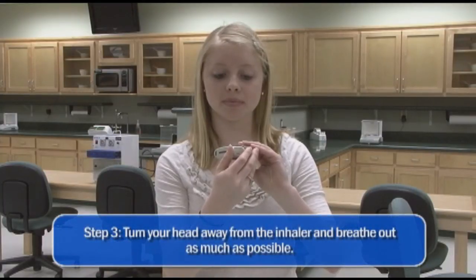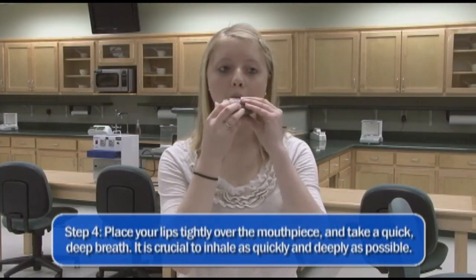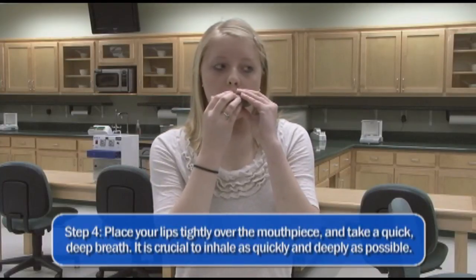Do not shake the inhaler. Now turn your head away from the inhaler and breathe out as much as possible. Place your lips tightly over the mouthpiece and take a quick, deep breath. It is crucial to inhale as quickly and deeply as possible.